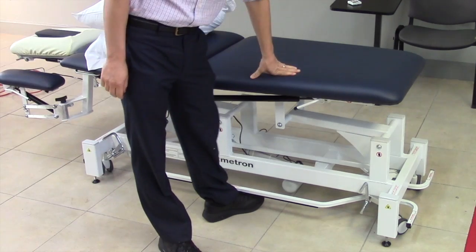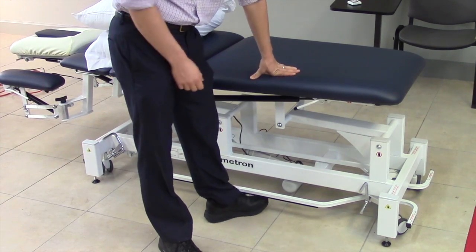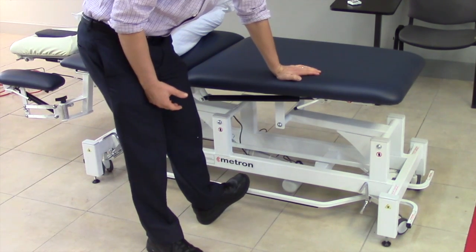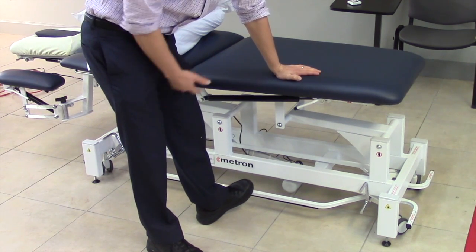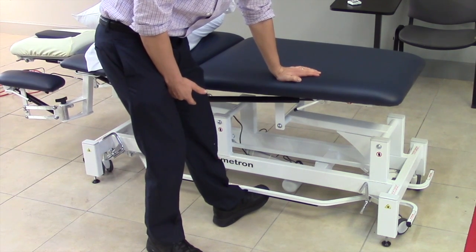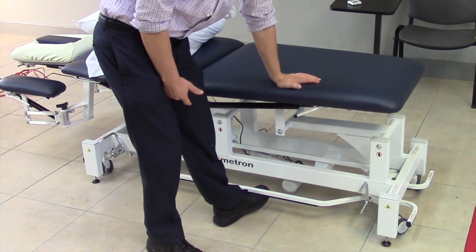Next we're going to look at how to raise and lower the table. There is a bar situated near your feet. When you push down on it, the table goes up, and when you pull up on it, the table goes down.